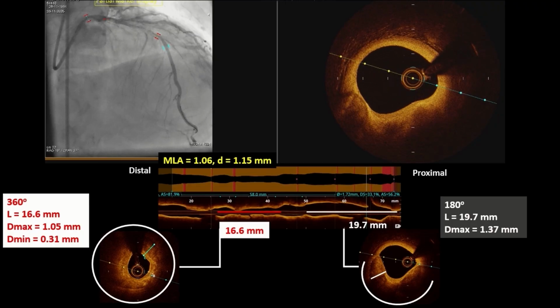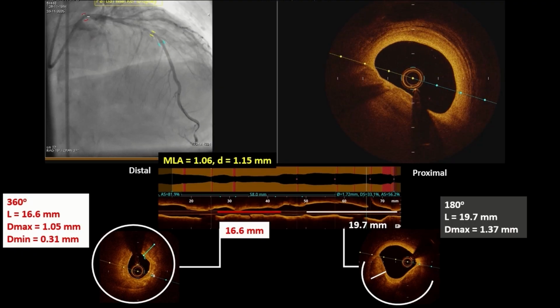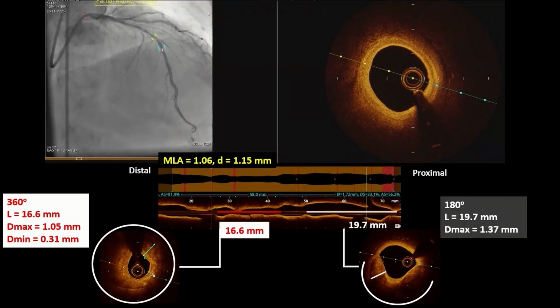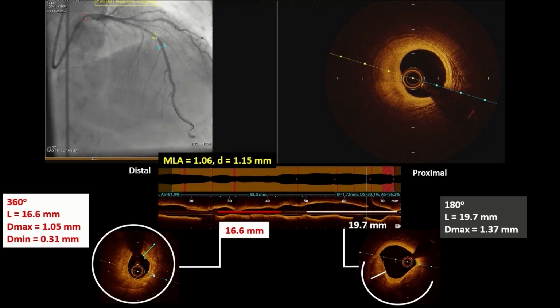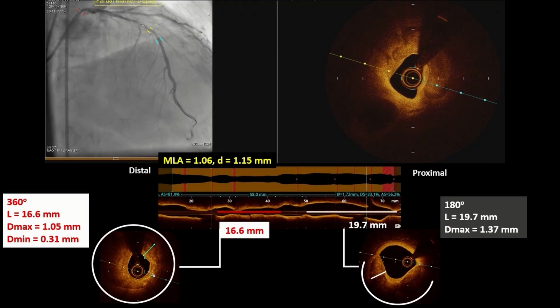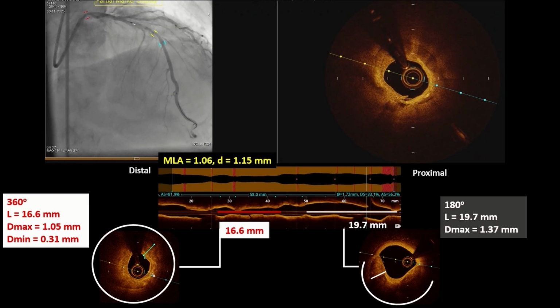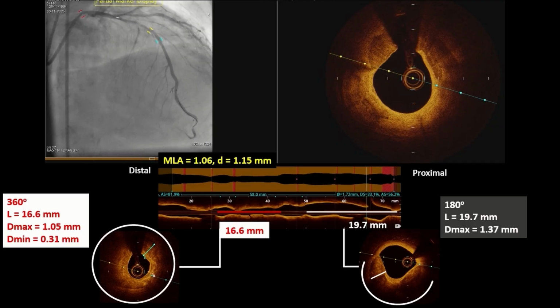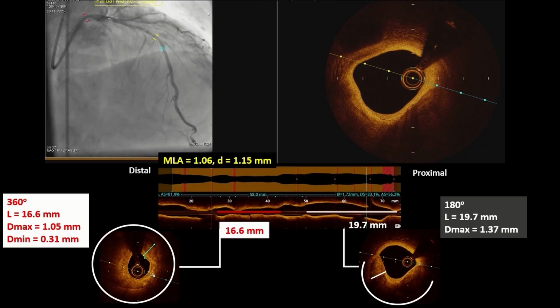The second segment, from diagonal 1 to the ostium of the left main, has eccentric superficial and or deep calcified lesions. Besides IVL, we can choose balloon-based modification such as a cutting balloon or scoring balloon. But the ostium left main calcified lesion, which we can see on IVUS only, can be treated by IVL or orbital atherectomy. Therefore, IVL is still the right choice for the second segment.